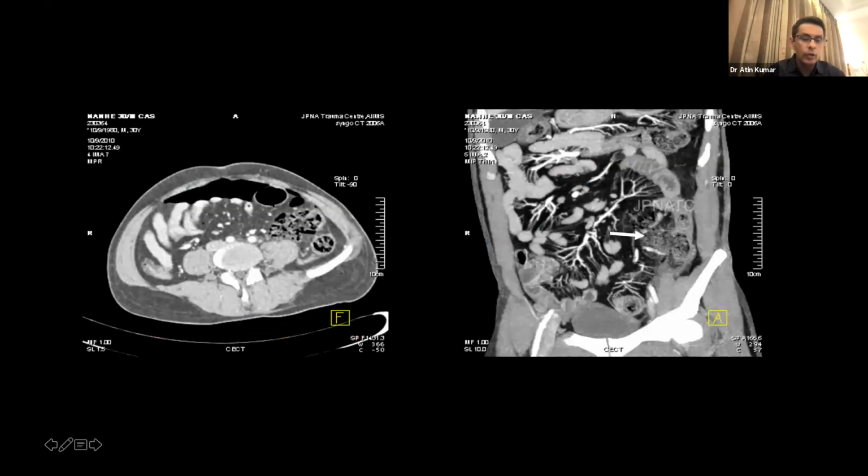So pneumoperitoneum is a clear-cut sign that there are chances of bowel injury. If you see pneumoperitoneum, even if you do not see the bowel injury, we think that there is a bowel injury, and the patients are usually taken up for at least a laparoscopy, and if the clinical signs are also present, laparotomy. The only other causes of pneumoperitoneum without bowel injury may be pneumomediastinum extending into the peritoneal cavity, or a stab wound, an open wound which gives rise to a peritoneal violation with external air going in. Other than that, pneumoperitoneum signifies a bowel injury.